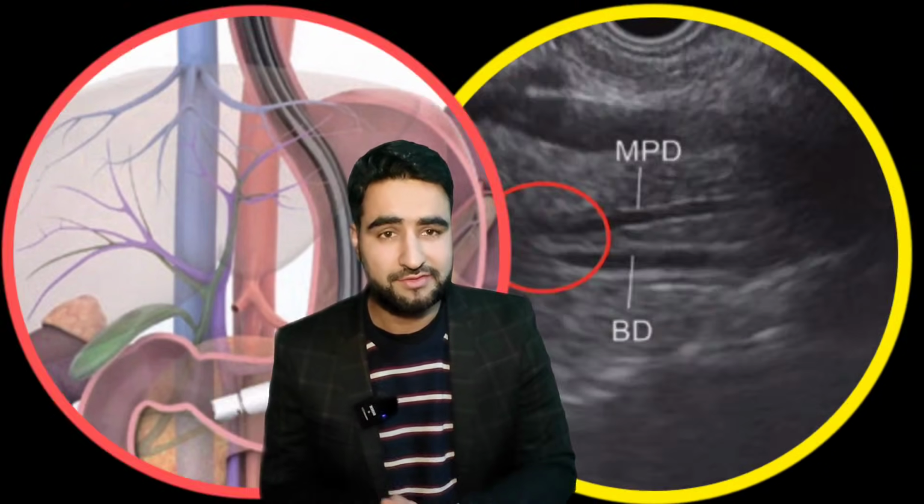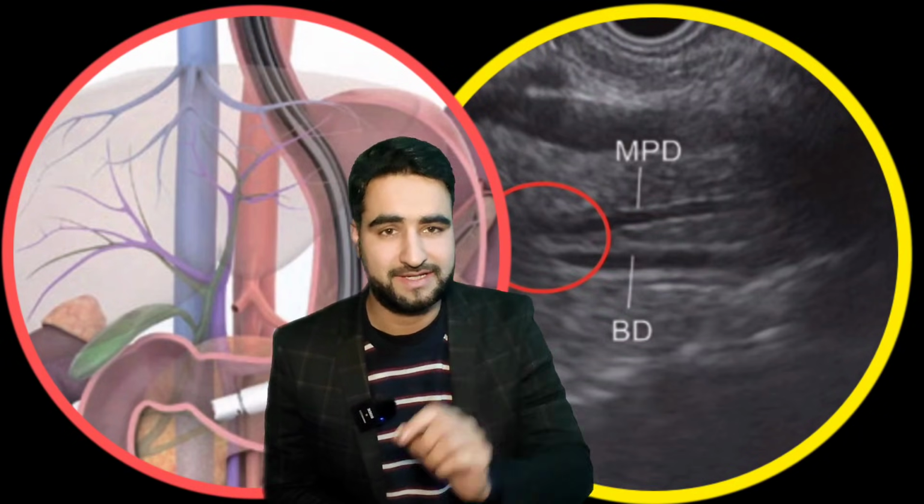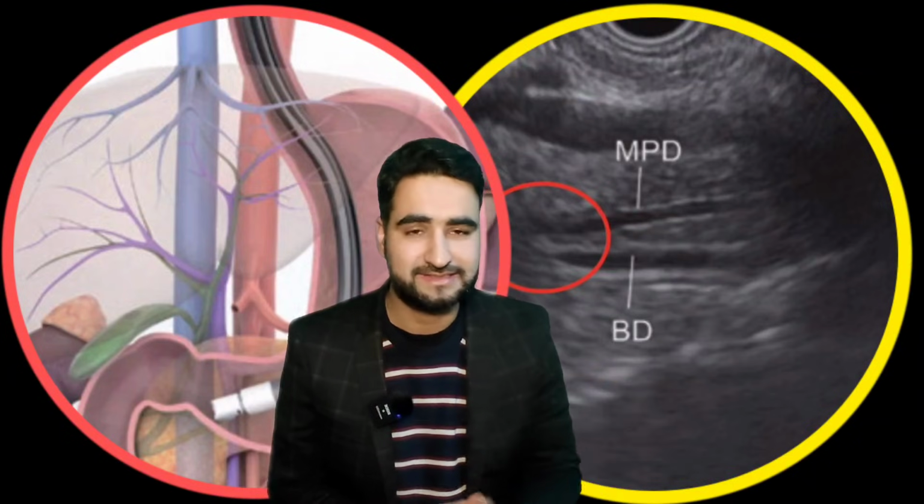Part below the superior mesenteric vein is the head of pancreas. This superior mesenteric vein serves as a natural anatomical divider, helping you distinguish pancreatic body from the head. Now continue advancing your scope continuously, imaging from the neck of pancreas along the main pancreatic duct.